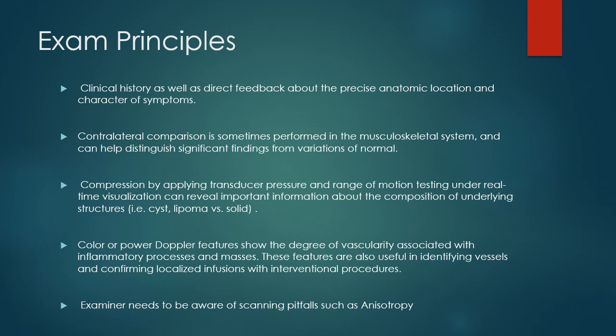Secondly, contralateral comparison is very important also, as it helps us to detect minor injuries that can be easily missed without doing a comparative study.